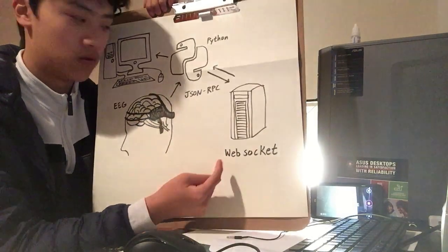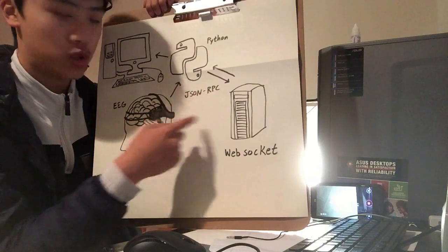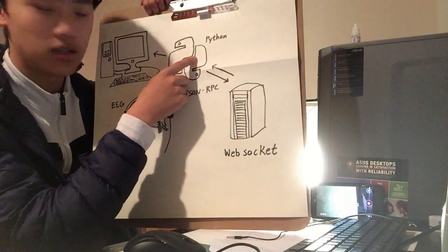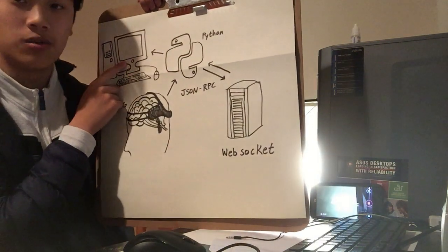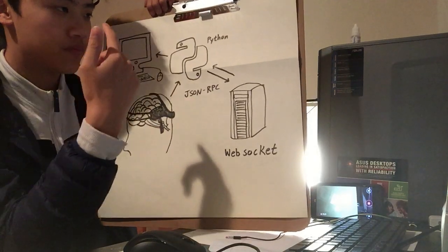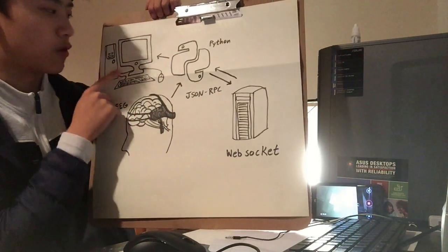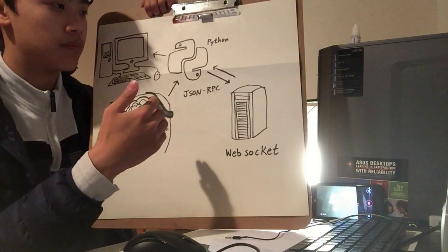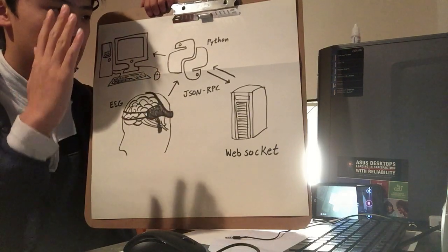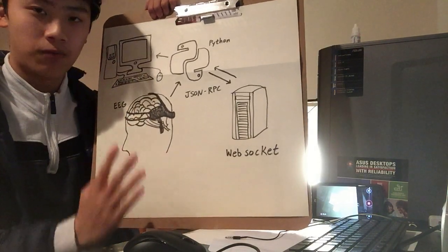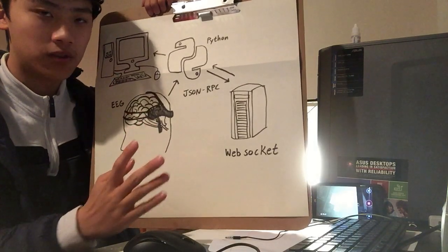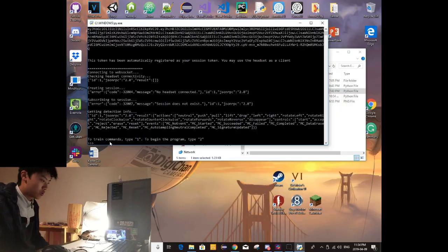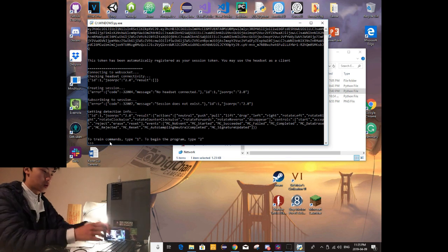The WebSocket sends back a response — the command corresponding to the data — back to the Python program, which then sends it to my monitor and performs an action based on that command. In this program, the command is one of five: the four directional commands — up, down, left, and right — and also a click command, since it's a cursor navigation program that moves the cursor based on the command.